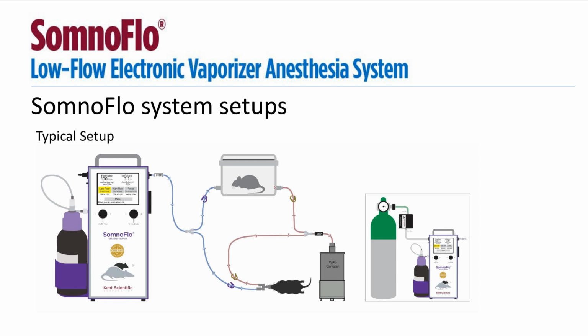So in this diagram, we see another typical setup with the induction chamber and face mask using the 2 accessory adapter. We have the anesthesia outlet here again in blue, which is the inspiratory line leading both to the face mask as well as the induction chamber. And leading out from the induction chamber and the face mask is the expiratory line marked in red, passively carrying any waste gases to your WAG canister.